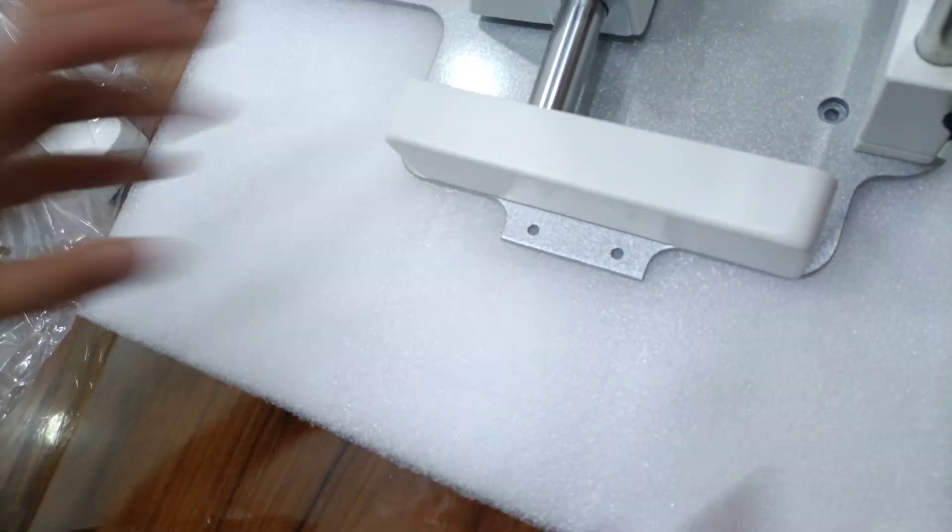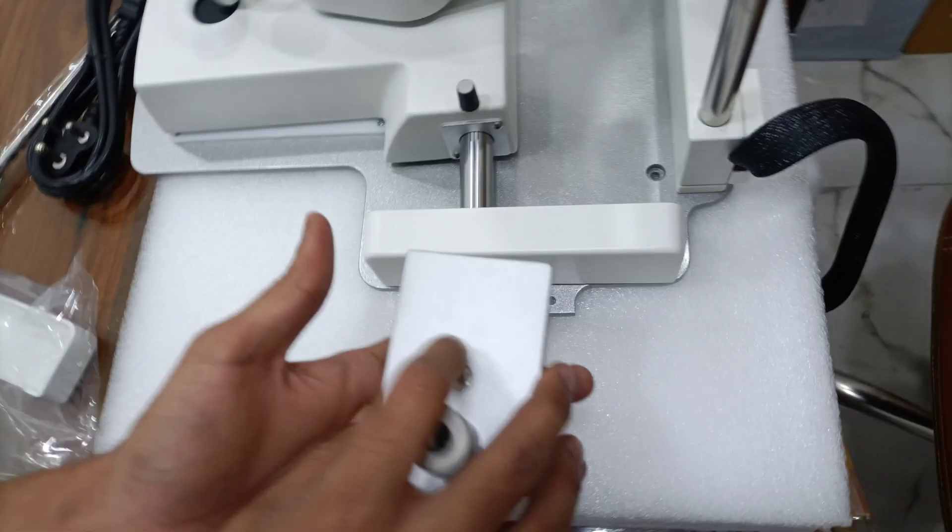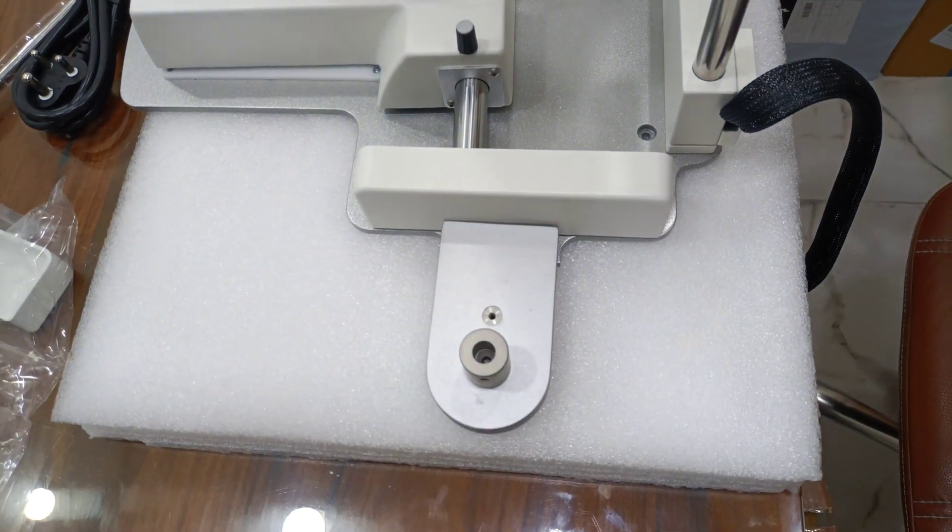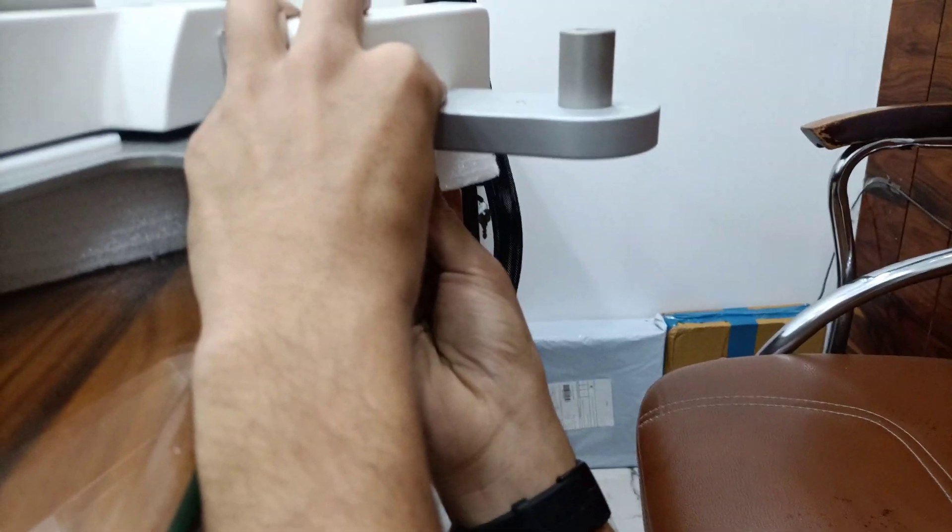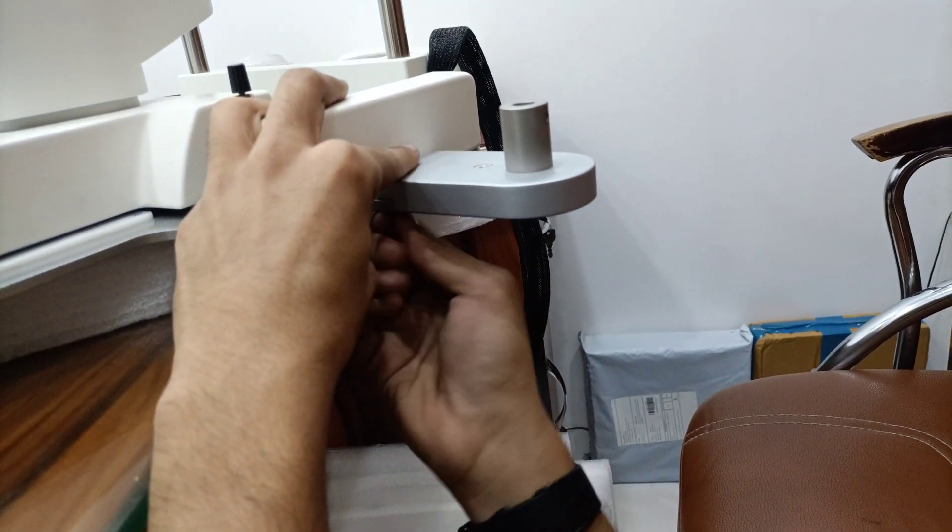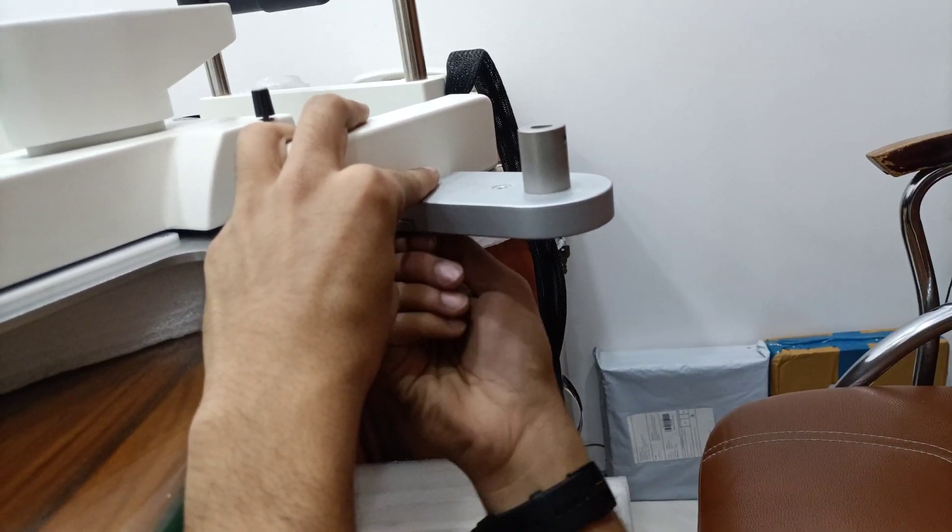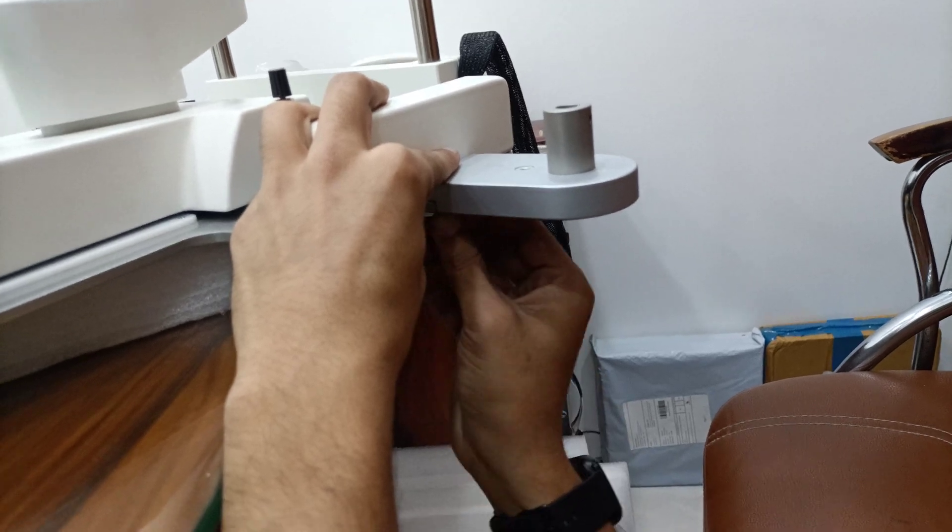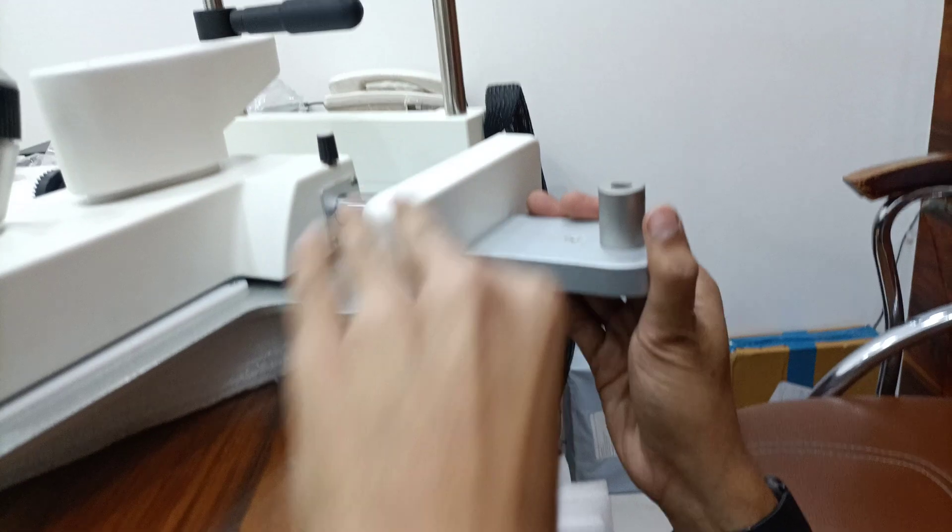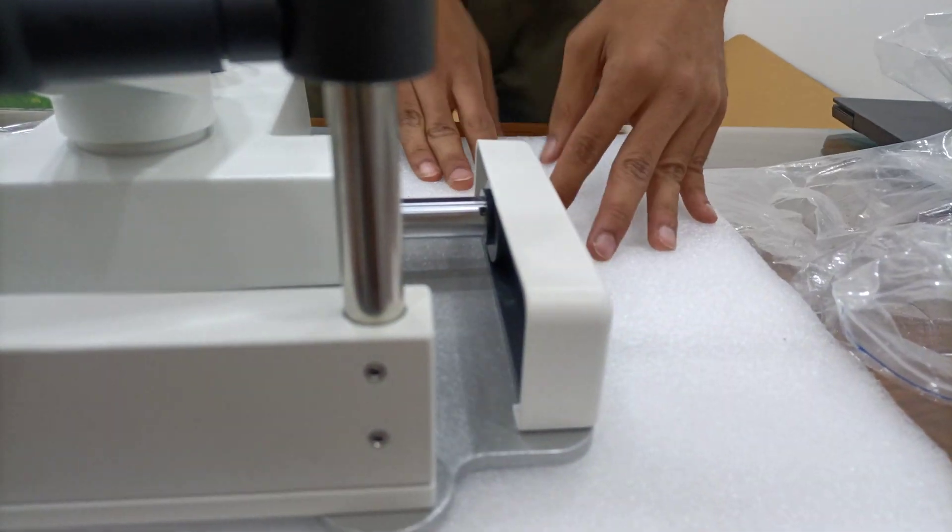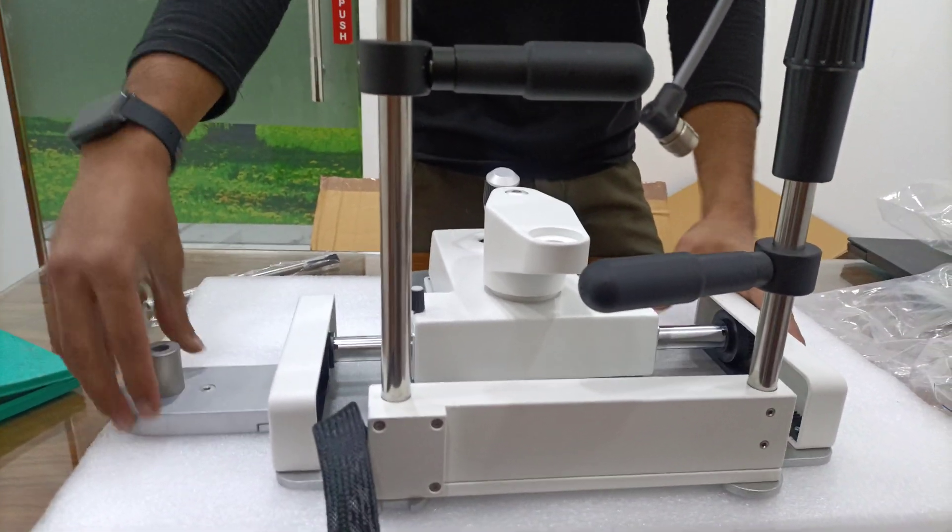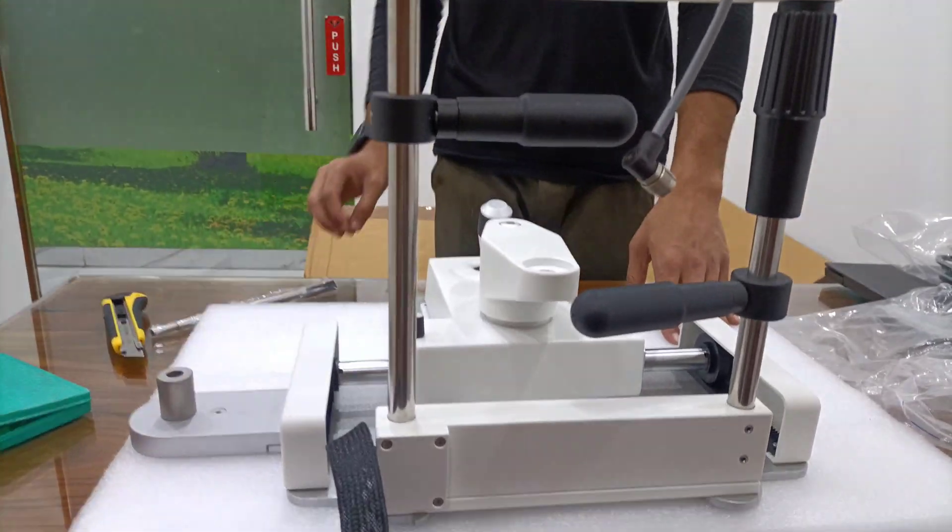We will cover. Now we will tight this. Tight. You have to use Allen key in all screws. Both covers fixed and transformer fixed.